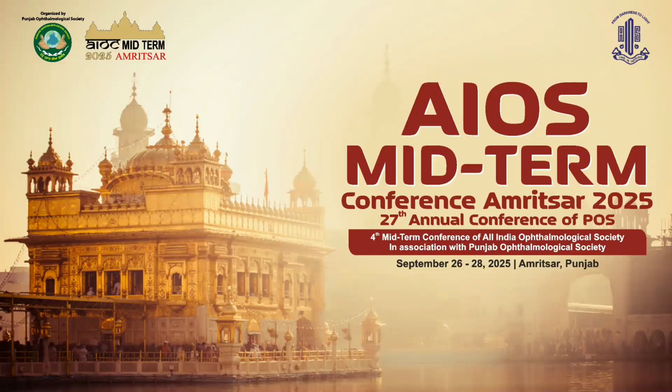If the patient has astigmatism, we have a lens wheel to change the diopter, to emmetropize the eye. What is Rekoss disc? Yes, the lens wheel is called Rekoss disc.